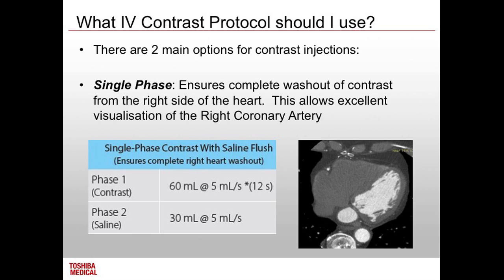The right coronary artery is the hardest artery to see. It has the highest velocity out of all the arteries as the heart beats. So whenever you're checking a coronary, and if anyone says to you, oh, do you think that's a good coronary? Look at the right. If you see the right's beautiful, circumscribed, no shadowing or looking fuzzy, then you know that it's going to be a good study, because most of the time the left side will be primo if you've got the right coronary artery looking like that. So that's why we do that.